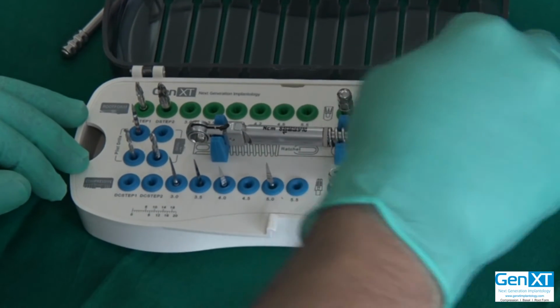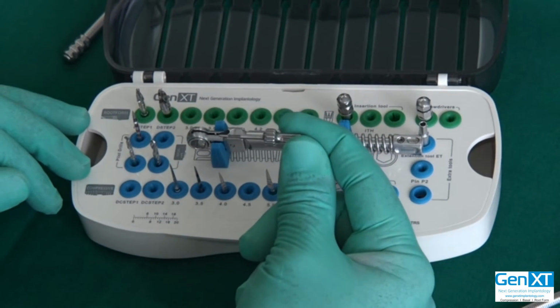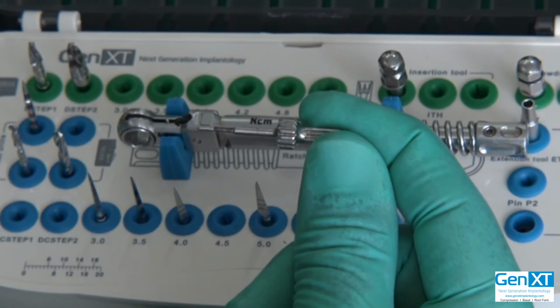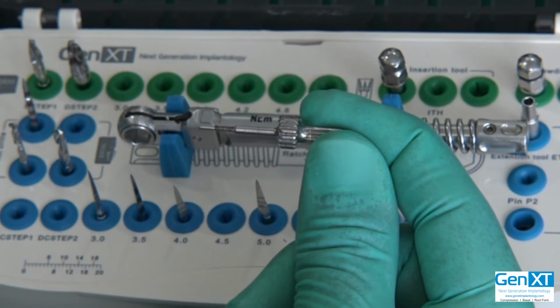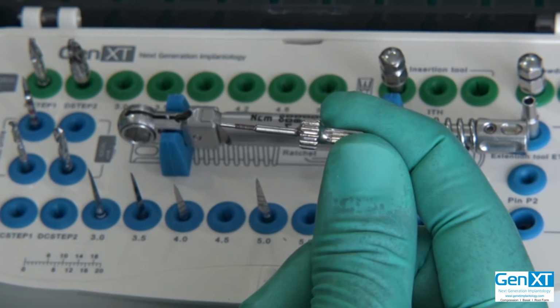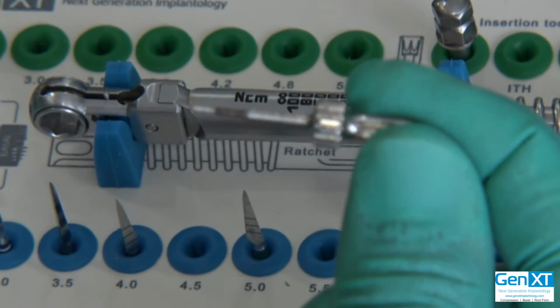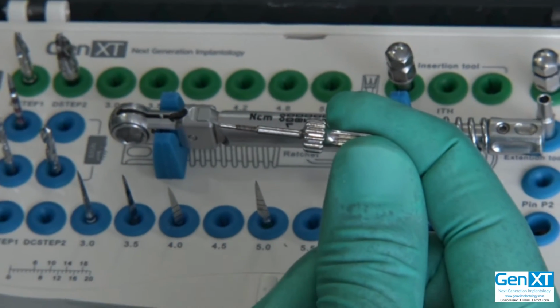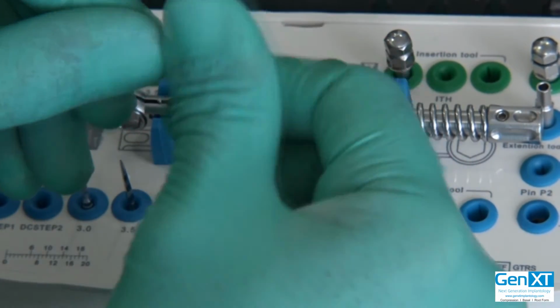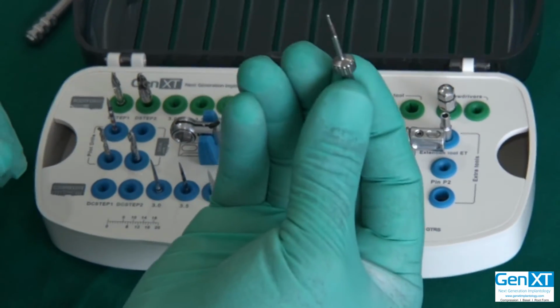Once you have removed the abutment screw, you will take this instrument, we call it SR. It is the removal instrument. This is the instrument that will help remove the abutment, break away the tight seal friction fit connection between the abutment and the implant. You can't just pull the abutment out, it is totally sealed inside. So you have to insert this, and as you turn it clockwise, it will thread in and push out the abutment. So this is the instrument for that.